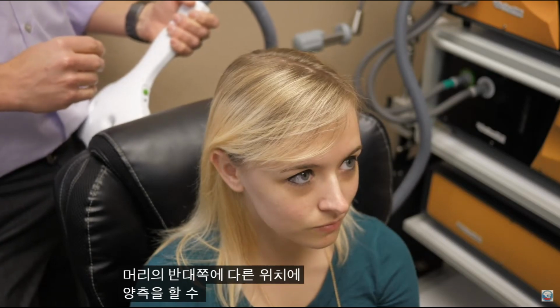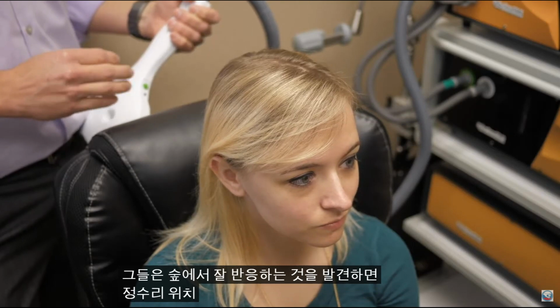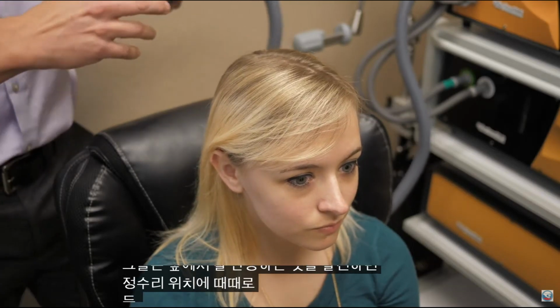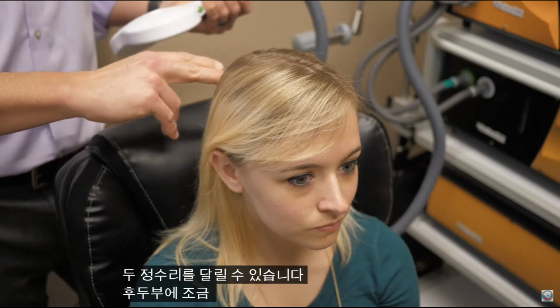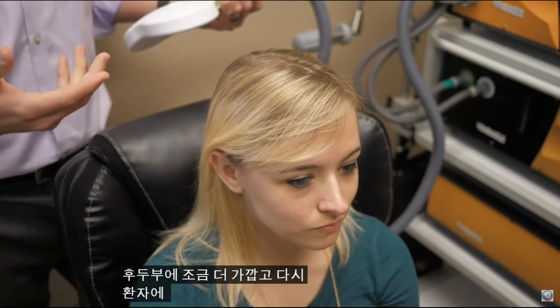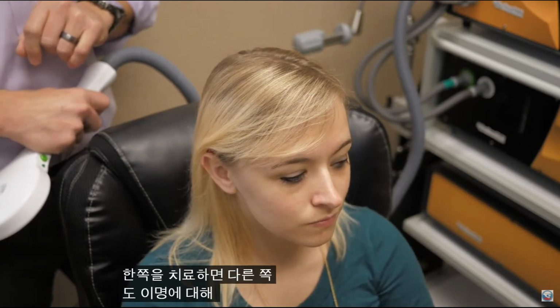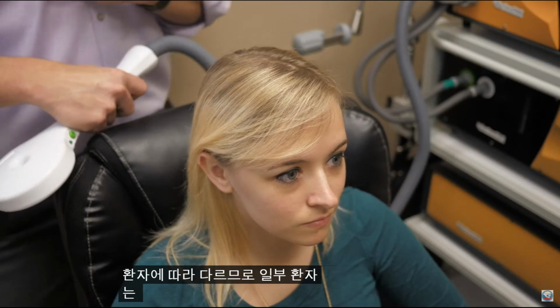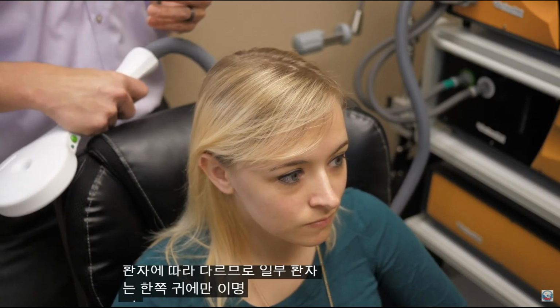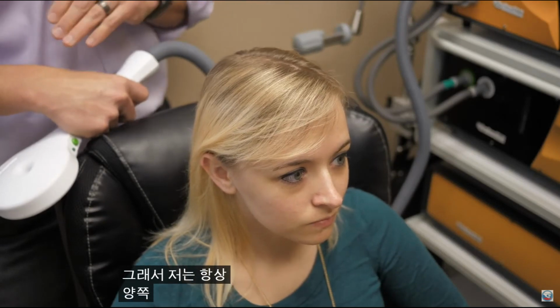Do you do bilateral if you find that they respond in the parietal location here? Well, sometimes it'll run to parietal, can get a little bit closer to even occipital, and again it depends on the patient. If you treated one side, would you also treat the other for tinnitus? Typically, it depends on the patient. So some patients only have tinnitus in one ear. I've found that most have bilateral. And so because of that, I'll always treat on both sides.